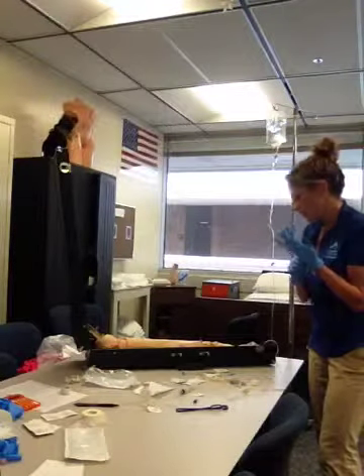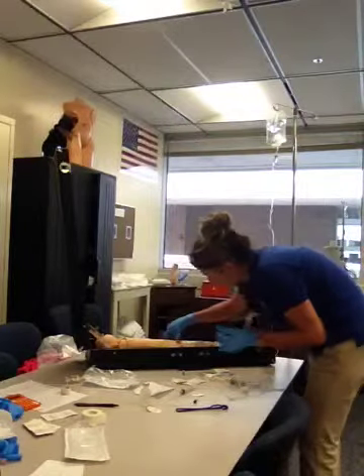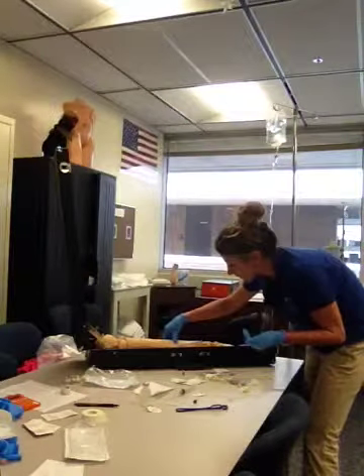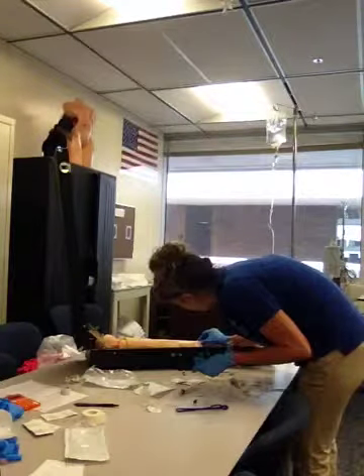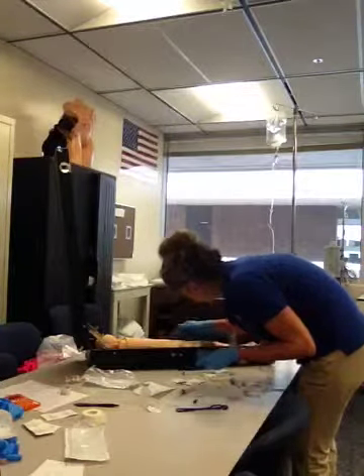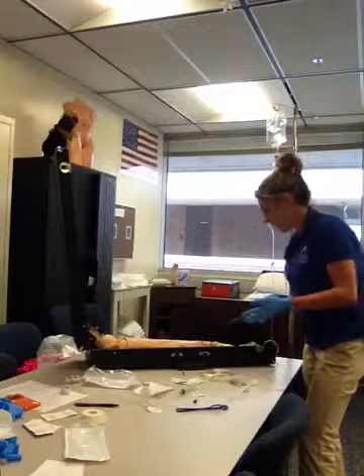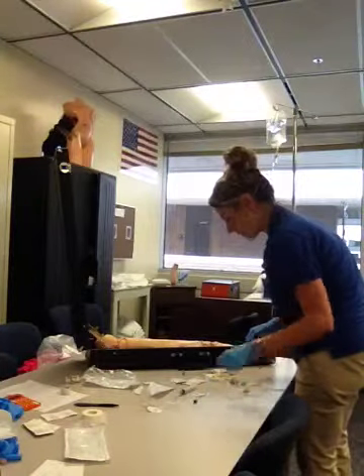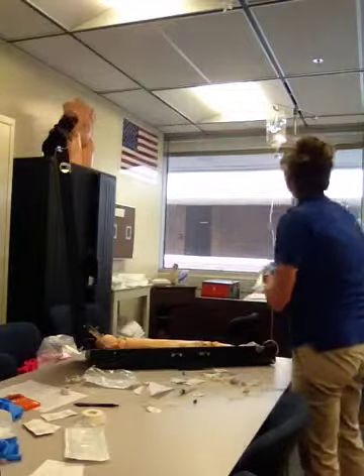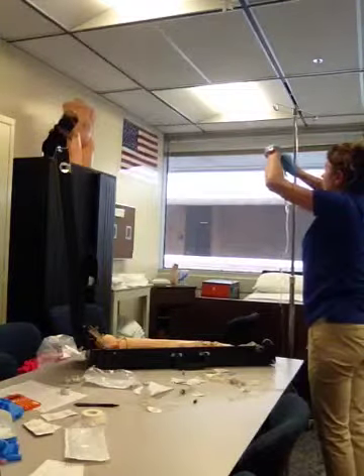I'm going to assess the existing IV site and make sure that we don't have any heat or phlebitis or any coolness from an infiltration. And it looks good, and Mrs. White doesn't complain of any pain at the site. Okay, so I'm going to take our existing line and drop it down lower.